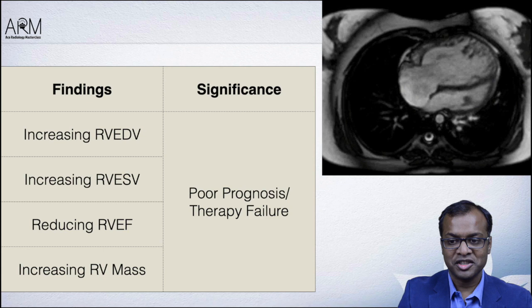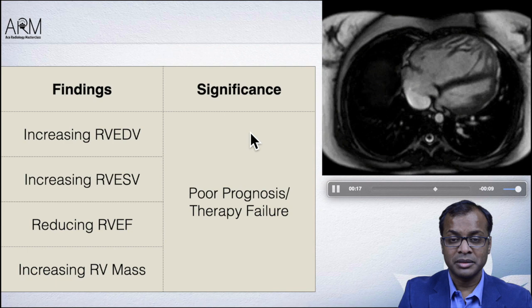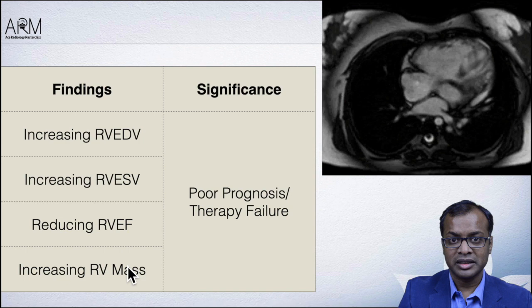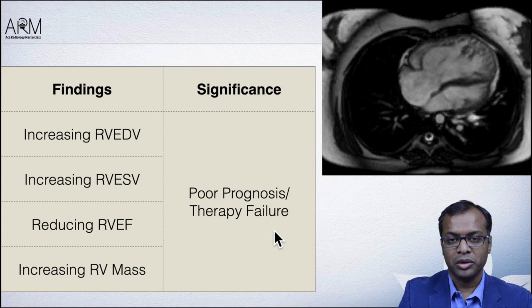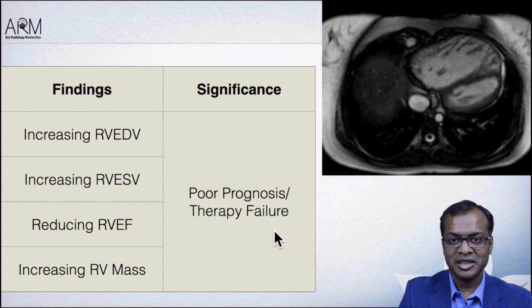MRI is of great value in assessing patients with pulmonary hypertension. You can very nicely see dilatation of the RV free wall, and as the RV dilates, you will also see the septum becoming dyskinetic and poking itself into the LV side, which is a poor prognostic feature. All of these parameters, especially if you are following patients up, will tell us whether the therapy being given is working or not. Cardiac MR is becoming more and more important in both diagnosis and follow-up of patients with pulmonary hypertension.